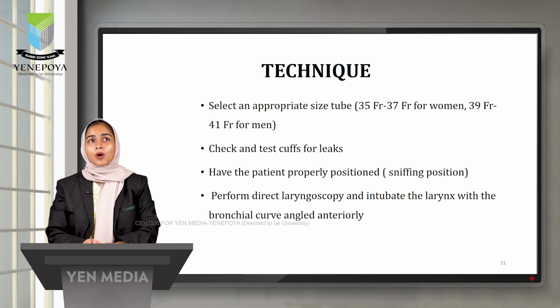Now we are moving to the proper insertion technique of double lumen tube. First we have to select an appropriate size tube, that is 35 to 37 French for women and 39 to 41 French for men. After that we have to check the cuff for leak. After checking the leak, we need to position the patient in the sniffing position, that is extension at the atlanto-occipital joint and flexion in the cervical spine.